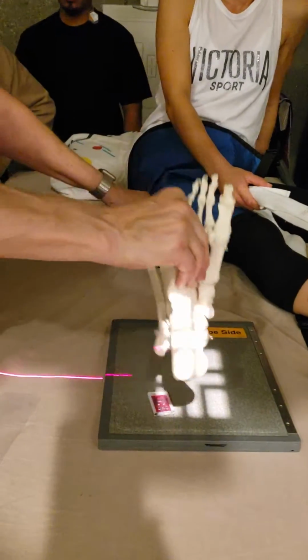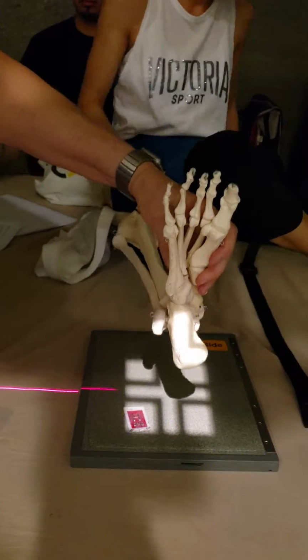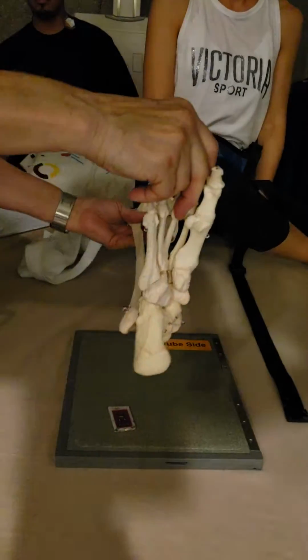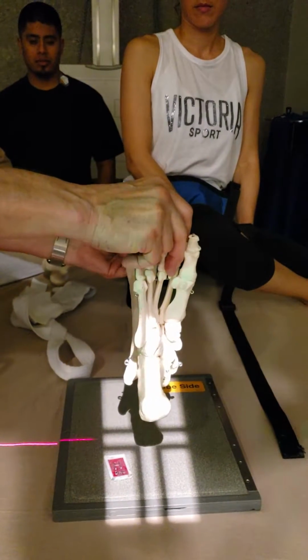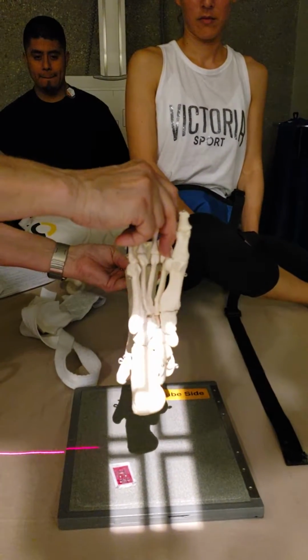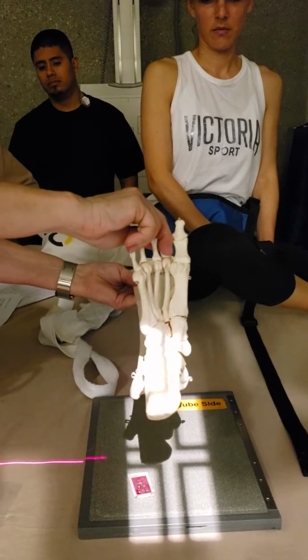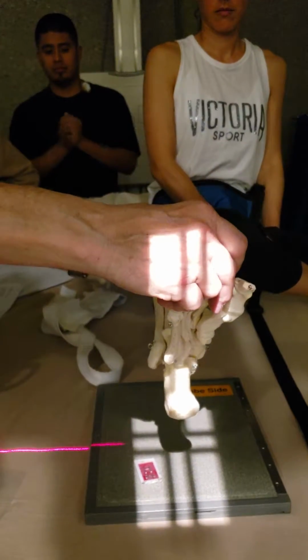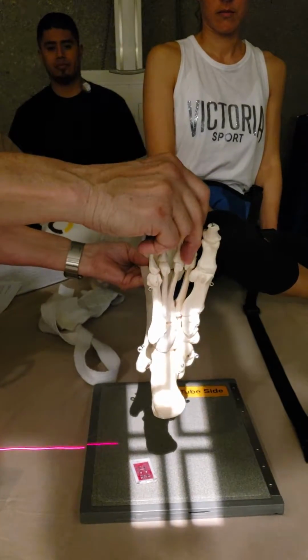So what we're doing is, see, here's the calcaneus. Now watch what happens. I'm going to bring this up a little bit so you can see it. So this is with the foot in a vertical. See the shape of the calcaneus? Go ahead and hit the light because I've got to do all three. Okay, now watch the shape of the calcaneus if I overextend the foot or overflex it. See how it foreshortens it? Can you see from that side? Now watch what happens if I don't extend the foot enough. See how it got elongated? So you have to have the foot in the right vertical position.